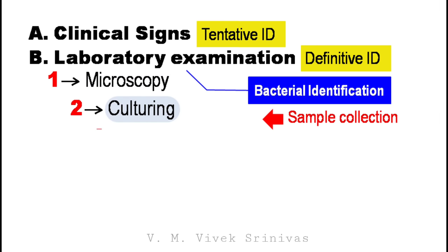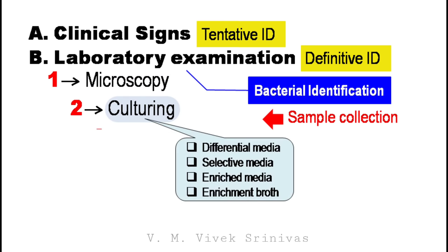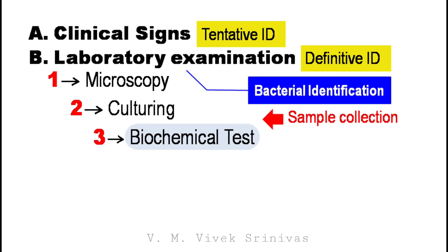Next, by culturing the bacteria onto different types of bacterial culture media, like the differential media, the selective media, the enriched media, and the enrichment broth. And next, by the biochemical tests. These tests will be detailed in this video presentation.